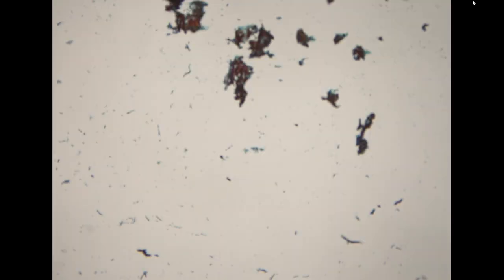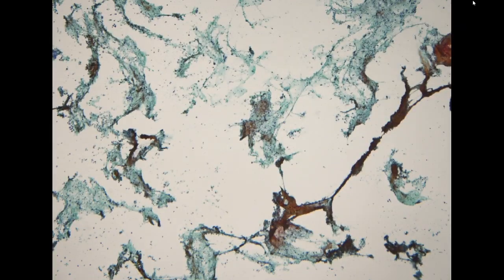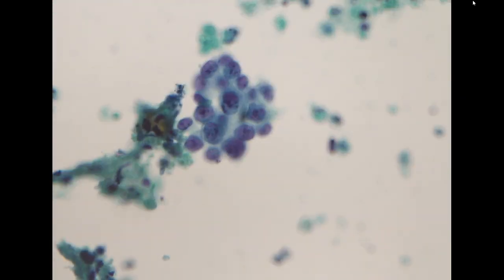So the next specimen is a CSF specimen. This is the most cellular CSF specimen that I ever see. The patient had a history of lung cancer. In this specimen, we see a background which is highly necrotic, suggesting there is a metastatic tumor with necrosis that seems to have ruptured and connected into the leptomeningeal spaces.